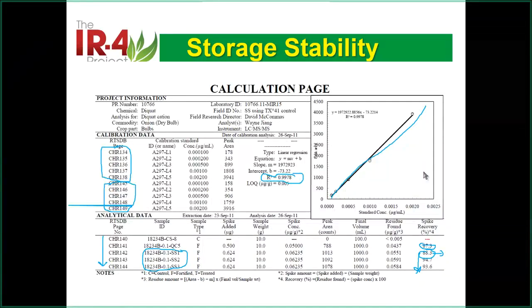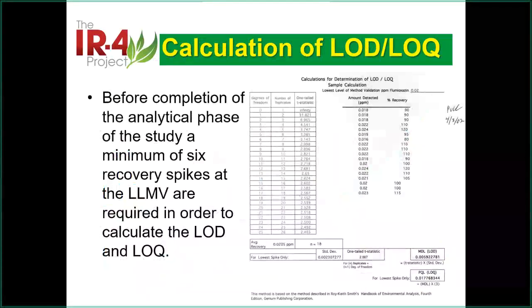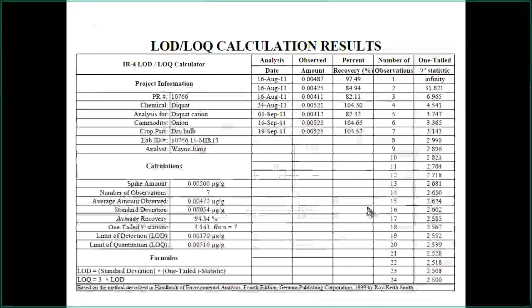And how we do LOQ, LOD, I just skipped that because we have the way to do that. If you went through my training, you pretty much know how to do that. I just quickly show you the formula we use for calculation. And that's why I mentioned last time, I prefer 7 or higher, because this number is easy to remember, because this is like a pi, 3.14. And the minimum is 6 in the ILV studies, because you use those 6 to do statistical result calculation.